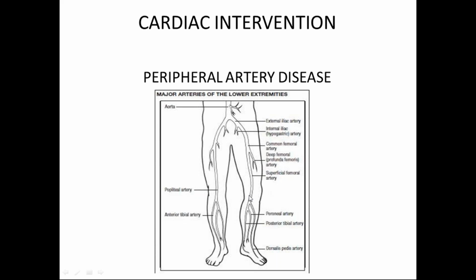And then of course the blood vessels in the leg. On the medial aspect, you have the posterior tibial. Laterally, you're going to have the peroneal, and in the front, you have your anterior tibial. So when we put a cuff, say at the ankle, you're basically looking at the flow all along here, but remember, you're going to have cuffs at varying positions.